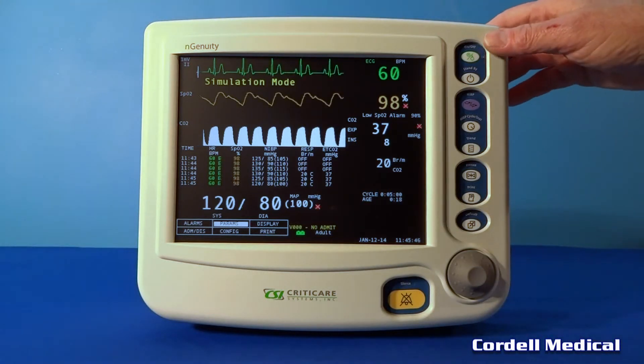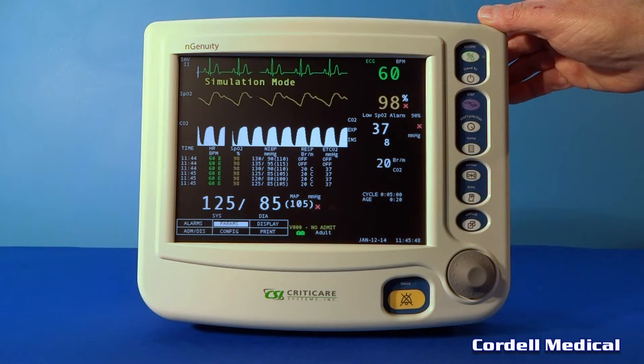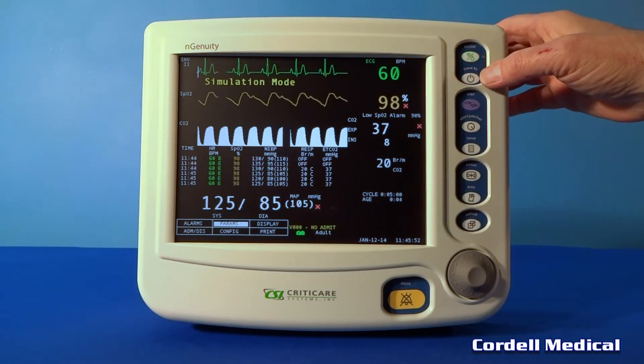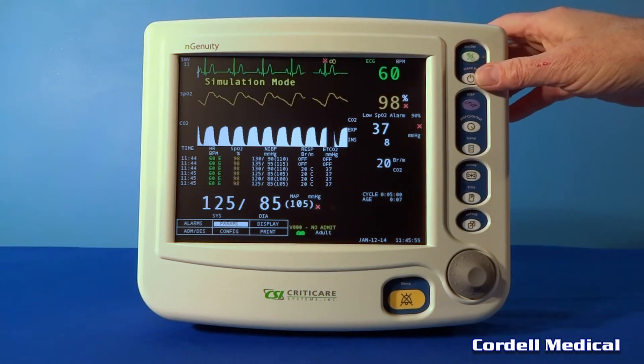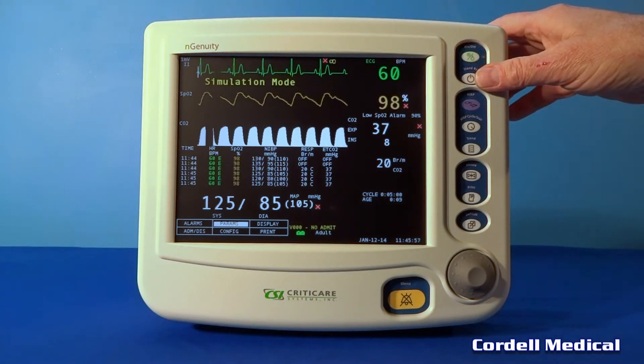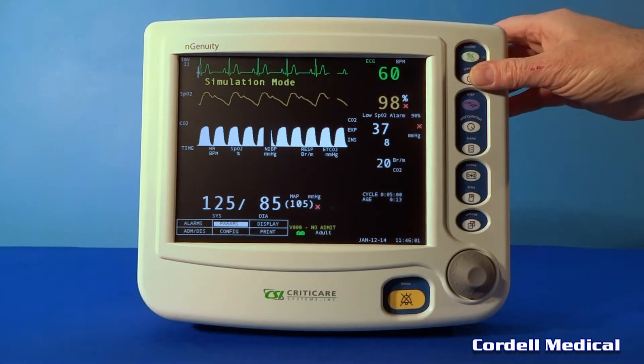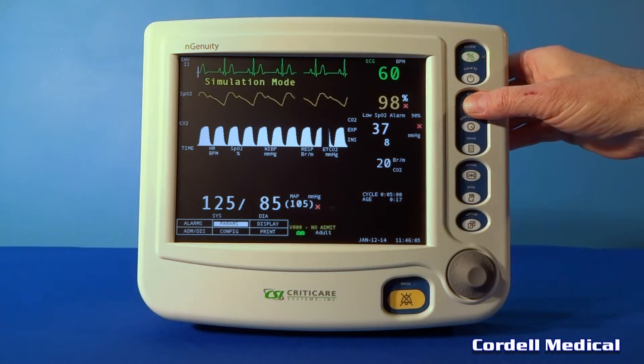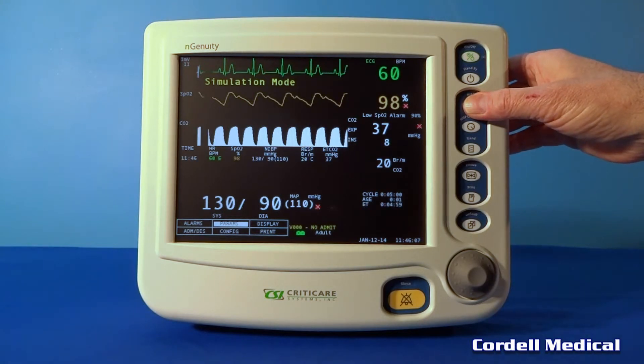Press the power key to activate the patient monitor. Press and hold to turn it off. Press the standby key to turn it on and press it again to turn it off. The NIBP button manually starts the blood pressure — press it again to stop.